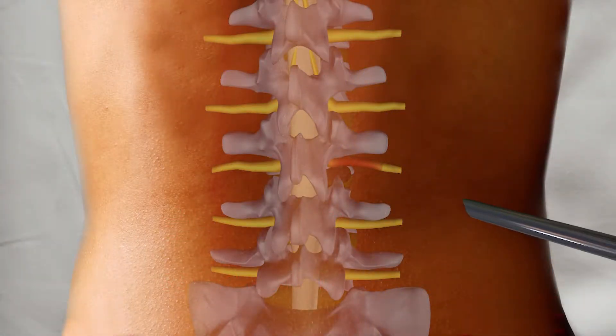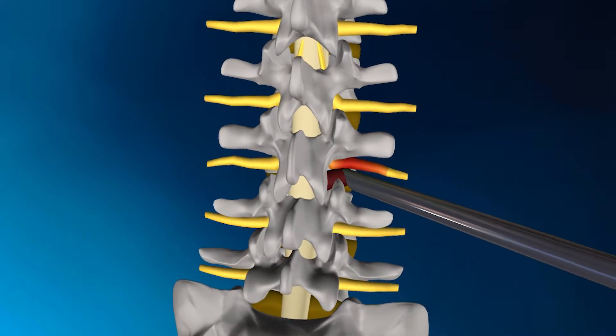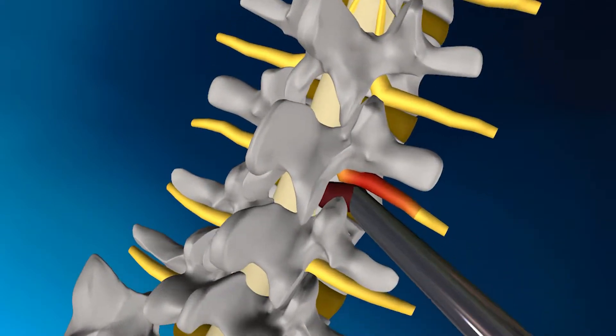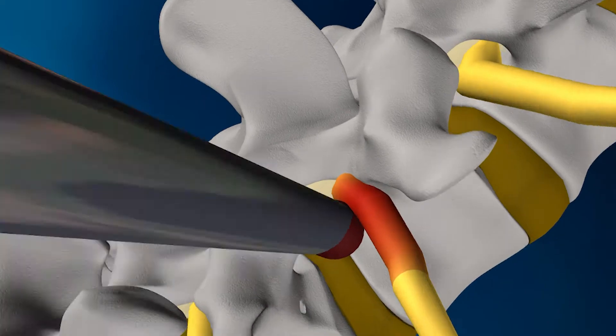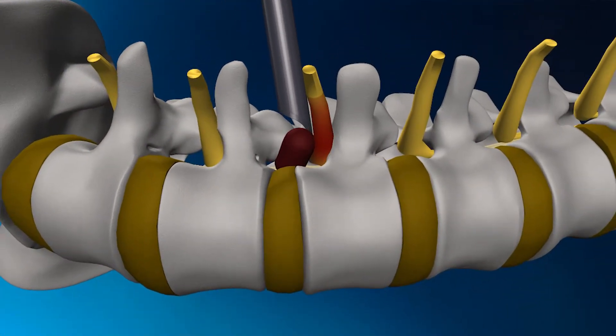The MEND procedure was developed to use a far lateral approach, accessing the disc herniation through the spine's natural opening. This allows for the removal of the disc herniation without disrupting any other tissue, so no bone or muscle is removed, which would further weaken the area.